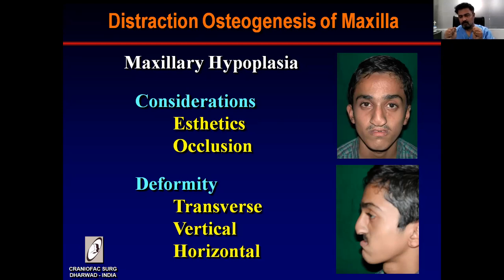But if you want more advancement, then there is a limitation in orthognathic surgery also: if your pedicle is moved more apart or more distance is there, then the blood supply will break and there is no bone formation. So in distraction, a small fracture is there, bone formation is there, then this is slowly set apart with the help of intraoral or extraoral distractors.